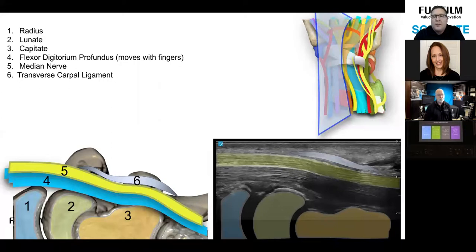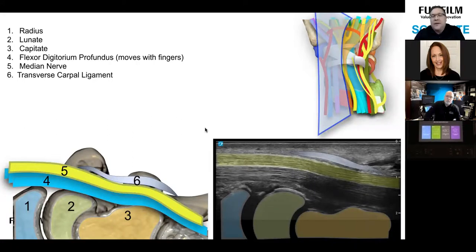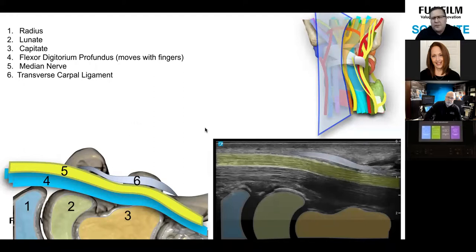Long axis is a very helpful view, but not the most prominent diagnostic view for entrapment, because the median nerve does flatten naturally distally. We use the long axis view to put the image into clinical context: do we see swelling such as tenosynovitis, fluid collections, ganglion cysts — where are they originating? Like the post-surgical complication pressing against the flexor tendons. Long axis is not used so much for measuring.